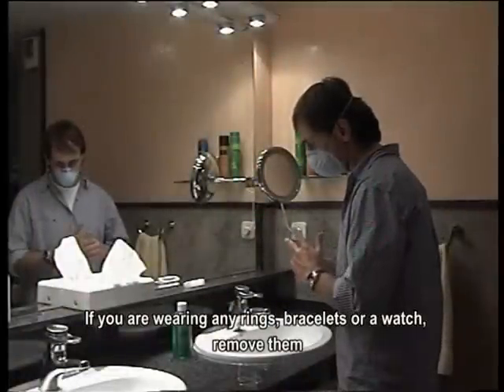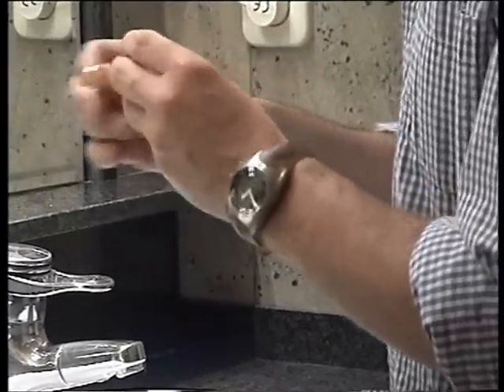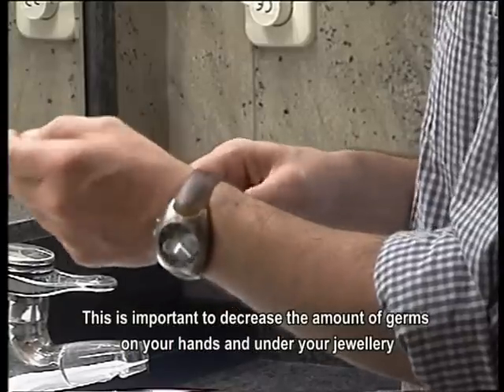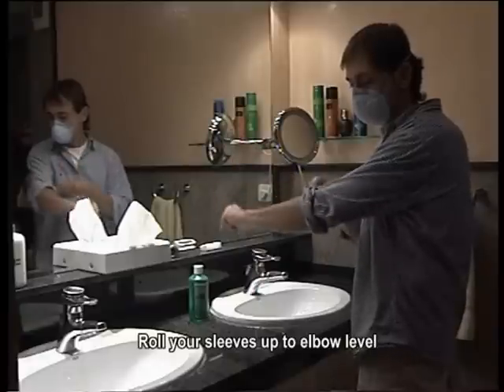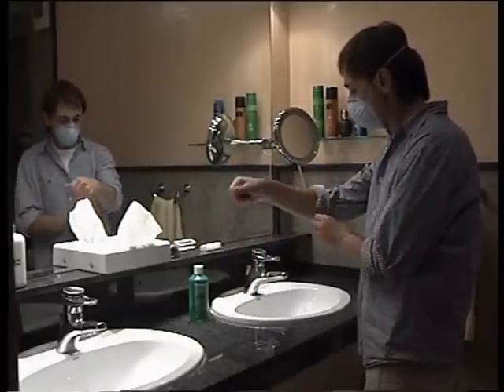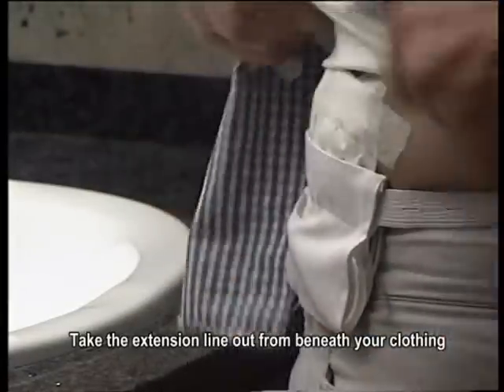If you're wearing any rings, bracelets or a watch, remove them. This is important to decrease the amount of germs on your hands and under your jewelry. Roll your sleeves up to elbow level. Fold back and secure any loose clothing. Take the extension line out from beneath your clothing.